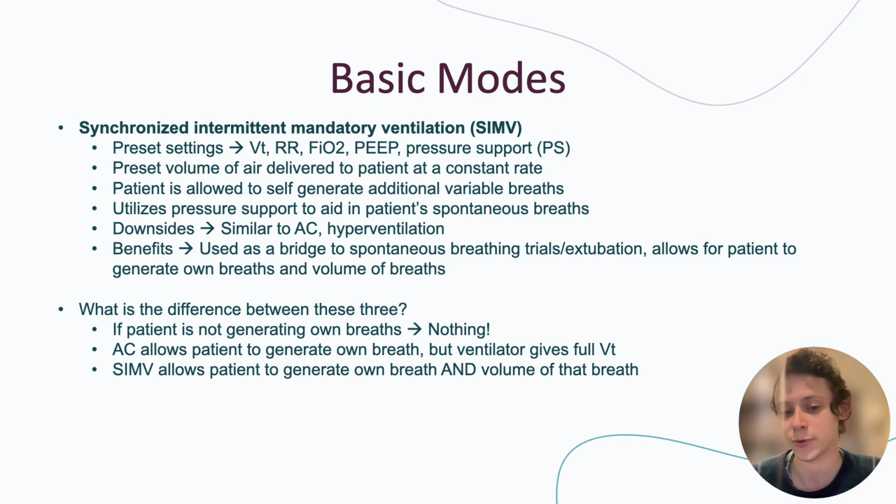However, if the patient is able to generate their own breaths, assist control is going to give the patient a full tidal volume during these spontaneous breaths, while SIMV is going to allow the patient to generate their own breaths and own volume of breaths in each of those. So those are the three basic modes that you should understand for mechanical ventilation and most commonly seen.